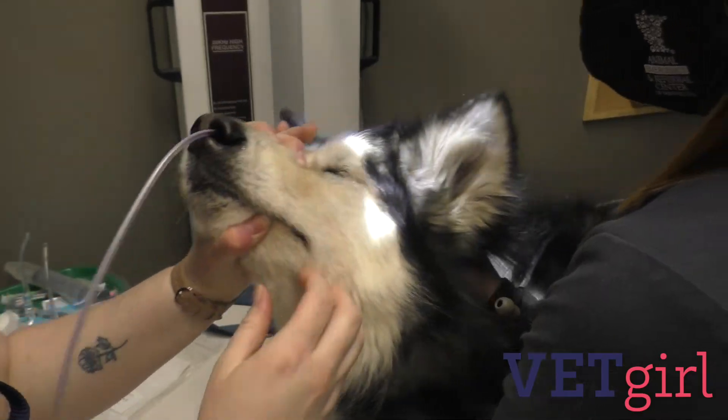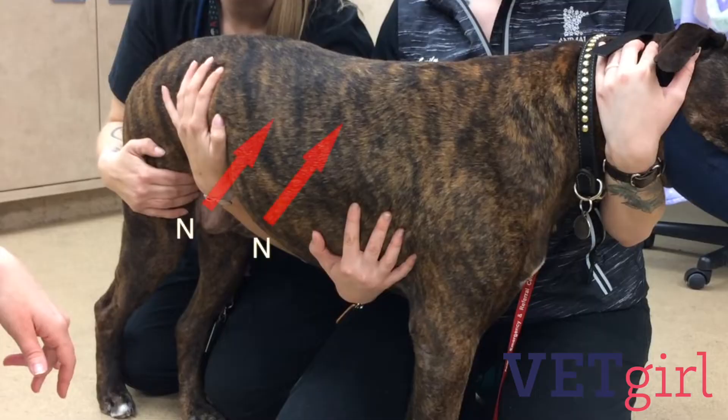To ensure appropriate length of placement, measure the feeding tube from the nostril to the 7th or 8th rib for an NE tube, or to the 13th rib for an NG tube. Mark this point on the feeding tube as a guide so you know how far in to insert the tube.